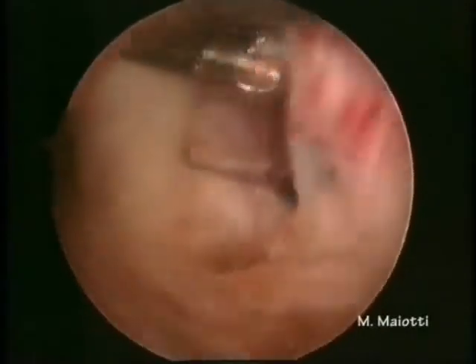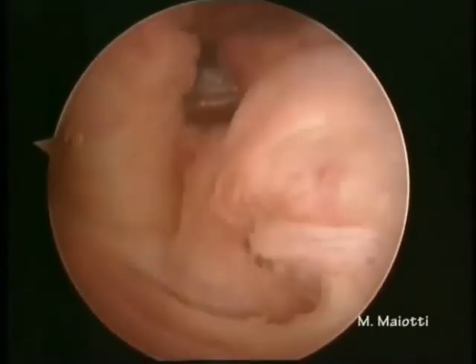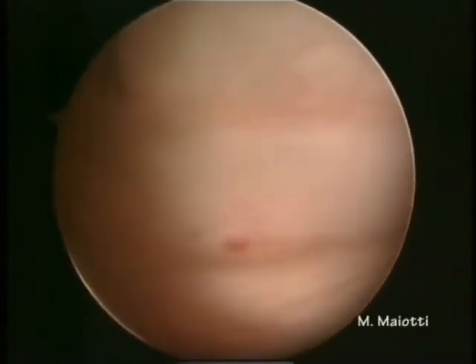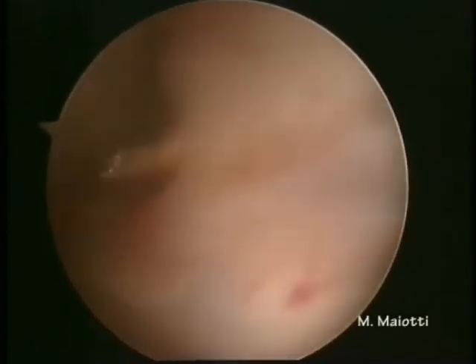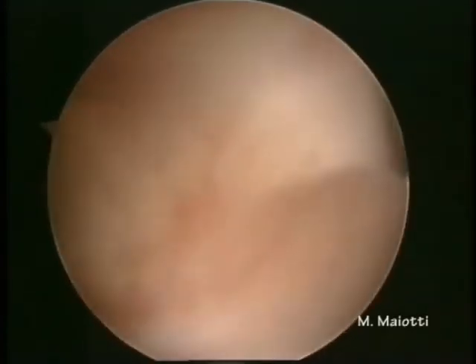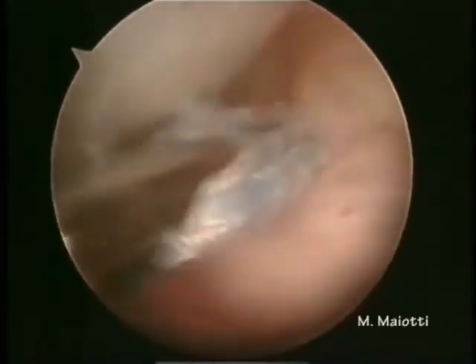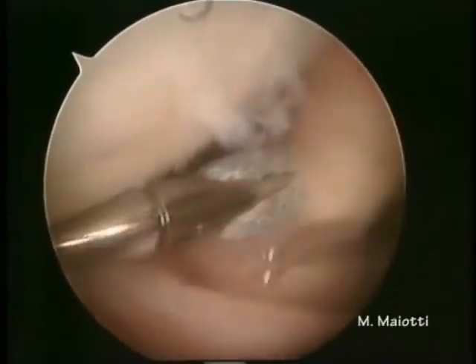The tape is assembled in the penetrator islet and passed through the inferior cannula. The middle part of the intra-articular portion of the subscapularis is penetrated. The free ends of the tape are then pulled out from the same lower cannula.